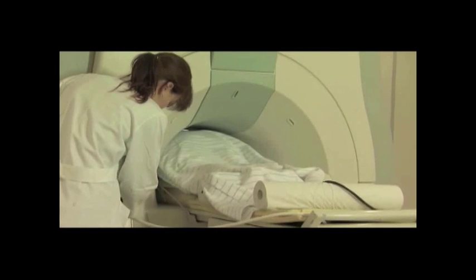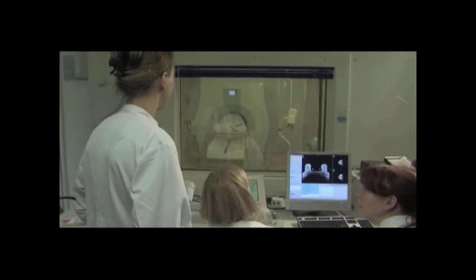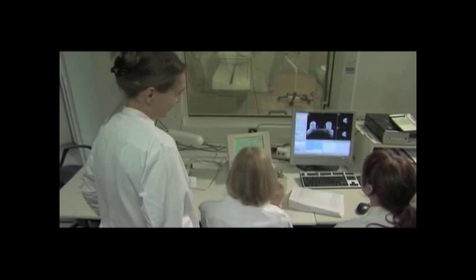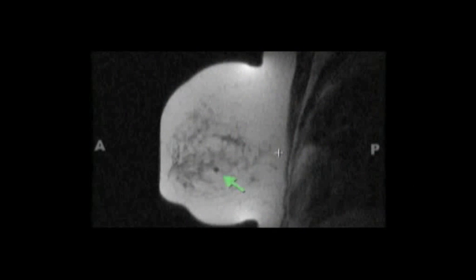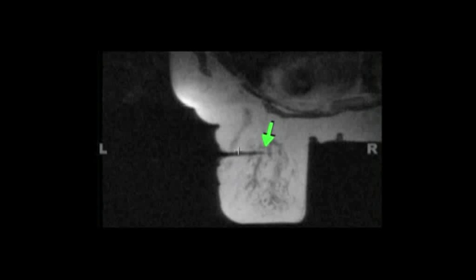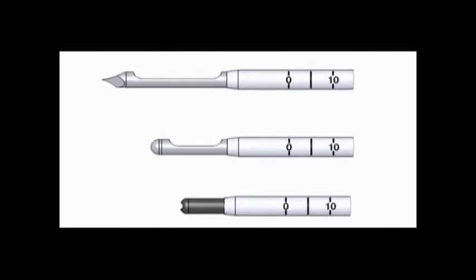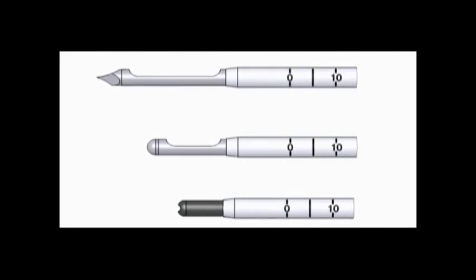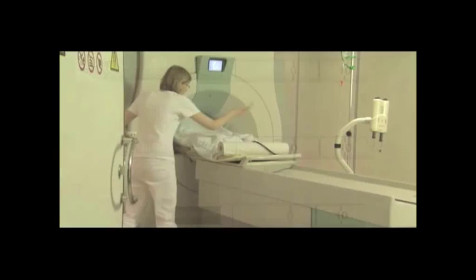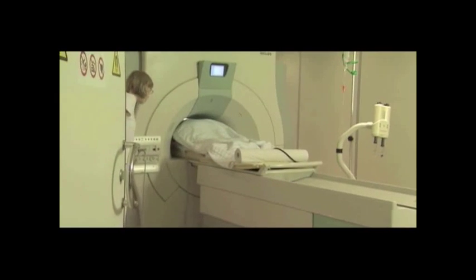Shuttle the patient back into the magnet. Acquire images in the sagittal and axial views to verify target accuracy. The localizing obturator will project as a signal void, appearing as a black dot on the sagittal image and as a black line on the axial image. The tip of the obturator will coincide with the center of the aperture of the biopsy needle. Once the target has been verified, shuttle the patient out of the magnet bore and proceed with the biopsy.